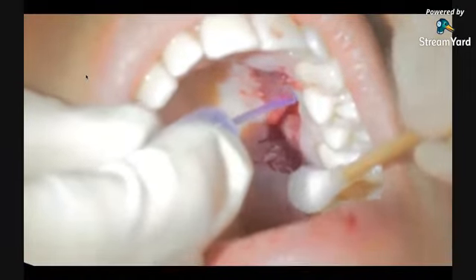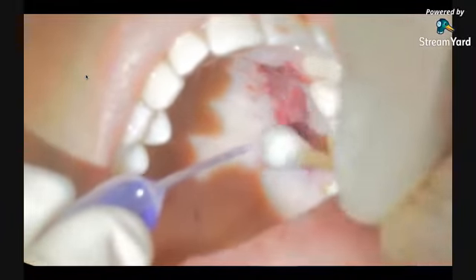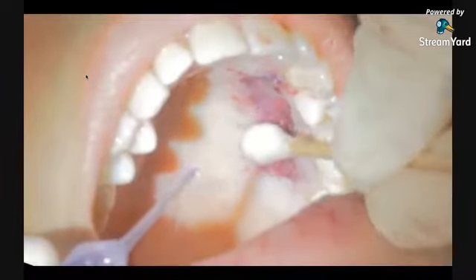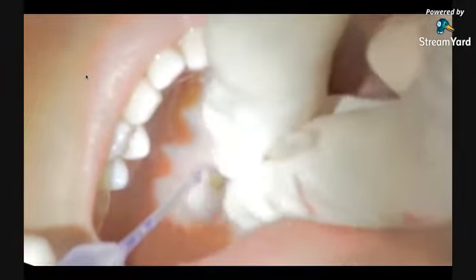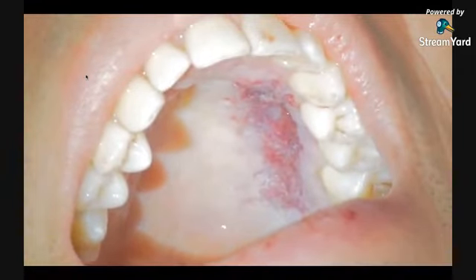You can apply it directly with the pipette, and you can polymerize the product directly with the syringe with saline solution, or with these tips embedded in saline solution, or you can grab some saliva from the patient. You can use a gauze embedded in saline solution, or what I use is to embed my finger in saliva to smooth the last layer of periacryl and have a very smooth layer. So you need 2-3 layers, it's enough and will stay there for 7 to 10 days.